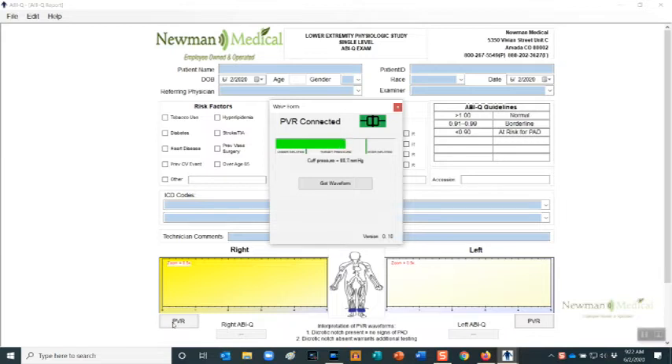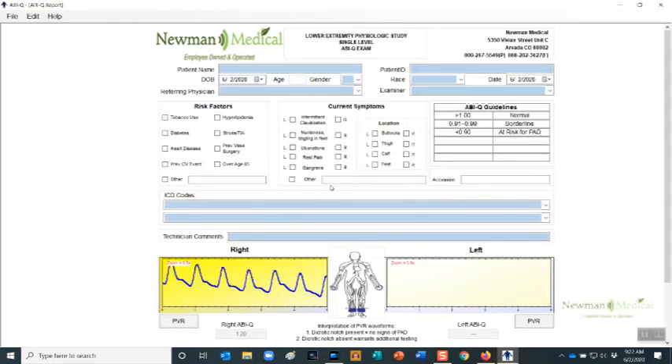The center section of the target pressure gauge will turn green. If red, the pressure is too low or too high. When a constant green, click on the Get Waveform button. Note: PVRs require patient cooperation — limb motion affects the waveform. Patients should be instructed not to move or talk during this test. The waveform will start to appear after approximately 10 seconds.